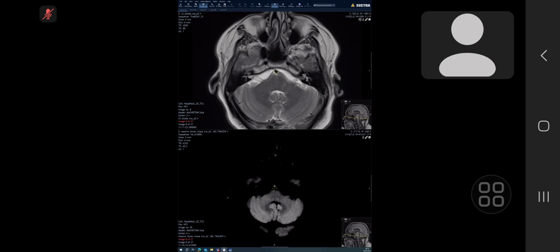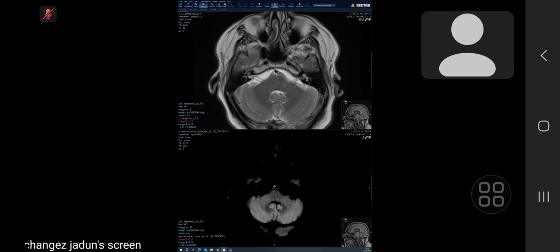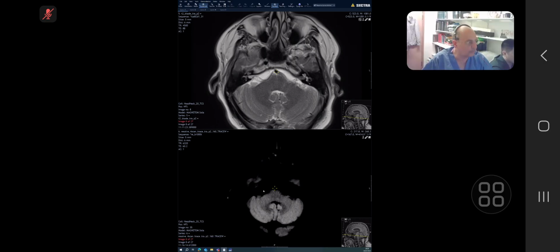Perfect. And also, because this is an acute infarct, you would straight away talk to the stroke team, because you can't let this patient go home. You have to inform the stroke team, because these days, once they rule out the hemorrhage, they immediately put these patients on dual antiplatelets. So that's something you need to know about.